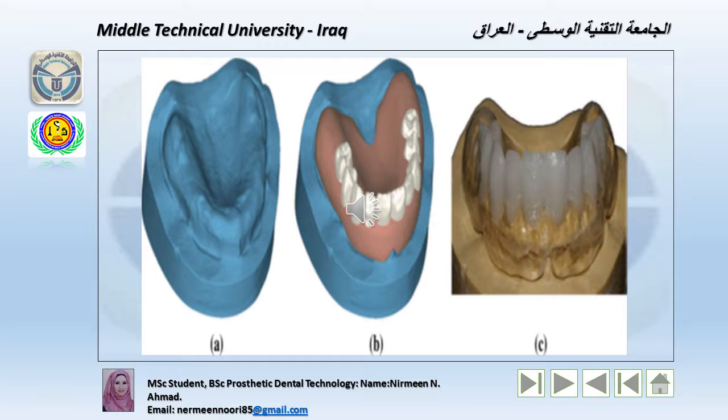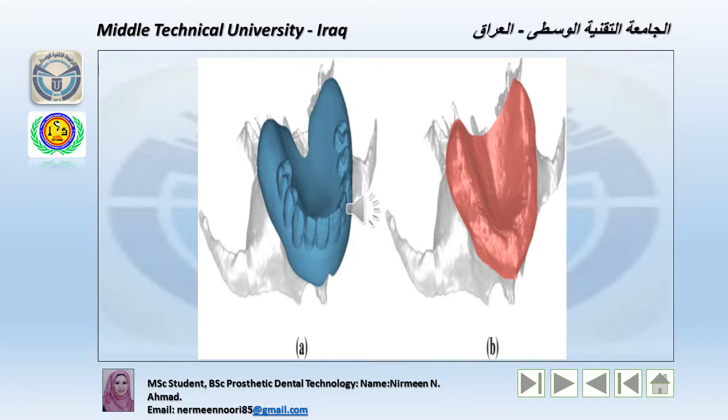The desired prosthetic outcome was modeled on the 3D digital mouth model by using the CAD platform. The diagnostic prosthesis was manufactured by the rapid prototype technique using two materials: transparent photopolymer for the soft tissue and a radio-opaque agent for the teeth.